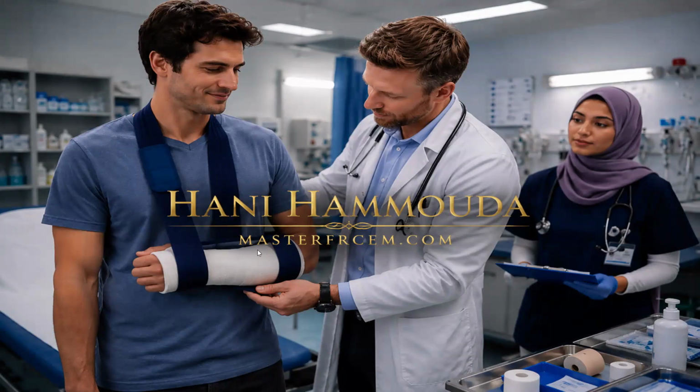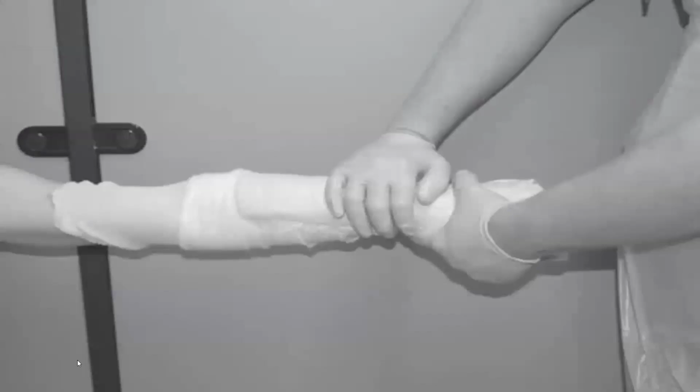Once you apply, in the exam, do you need to be very perfect? No. You are not an orthopedic doctor, and they are just checking the steps, not the perfection. Clear? I mean, for example, you put stockinette 15 centimeter above the elbow. No problem, don't worry.